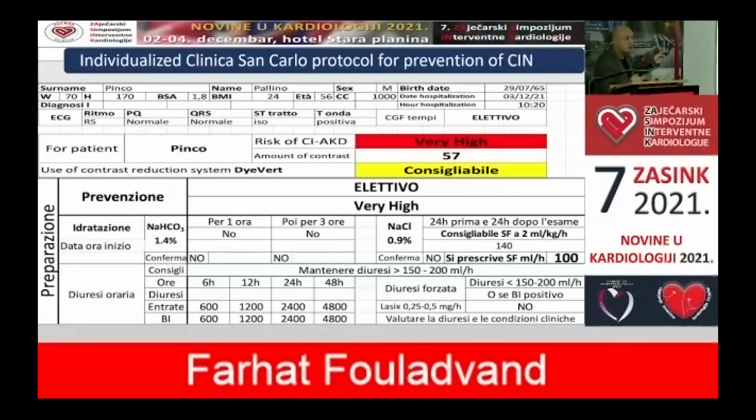The system says to you, it's advisable to use divert system. And the amount of the liquid that you can infuse in the patient is 140 according to the system. But the doctor says, no, I am afraid, I am going to put 100. My diploma is from the University of Pavia, for example. So I want to do 100 ml.